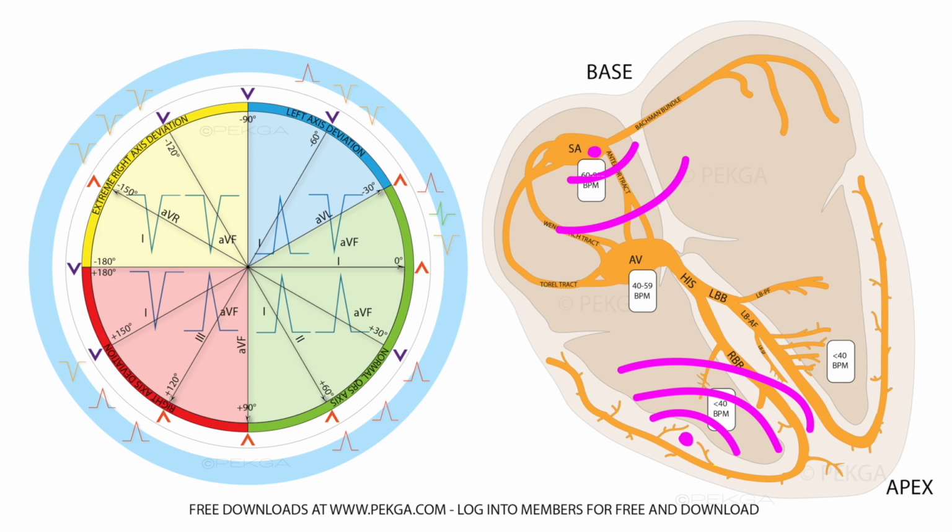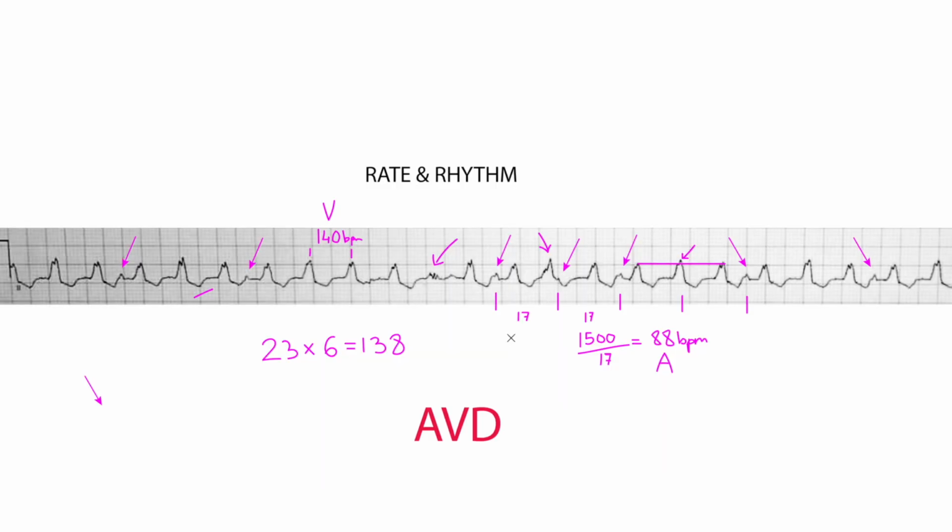And that is a hallmark feature of ventricular tachycardia. So in case you suspect ventricular tachycardia, or in case you get atrioventricular dissociation, if you see that on an ECG, there is a really, really high chance that you are dealing indeed with ventricular tachycardia.